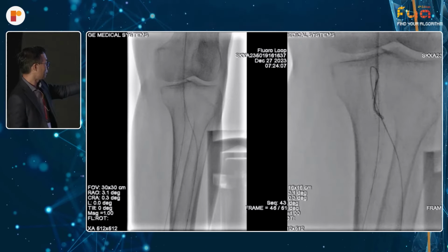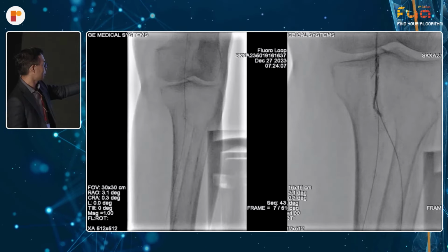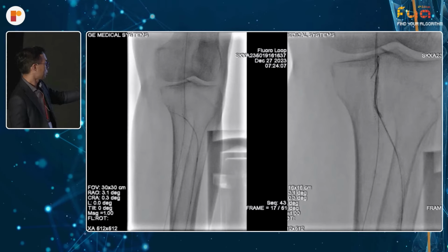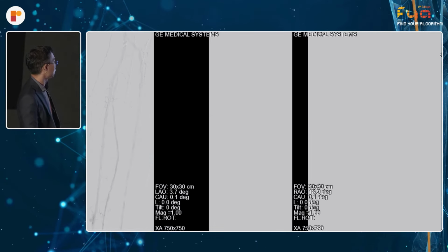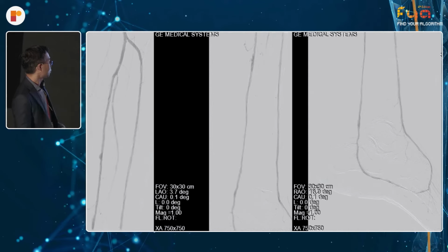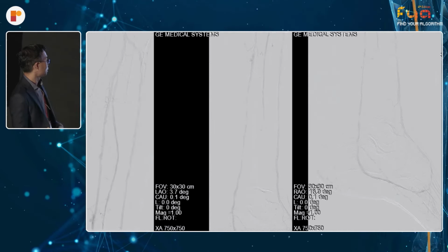So the final bit here is where the wire will enter into the anterior tibial artery through the bidirectional approach. And from there, from just the peroneal artery, you can reconstruct the entire trifurcation, get a nice posterior and anterior tibial artery flow, and reconstruct the plantar arch in this instance.